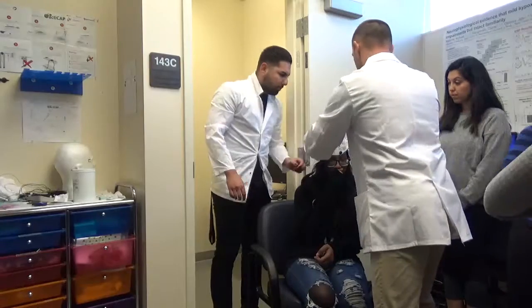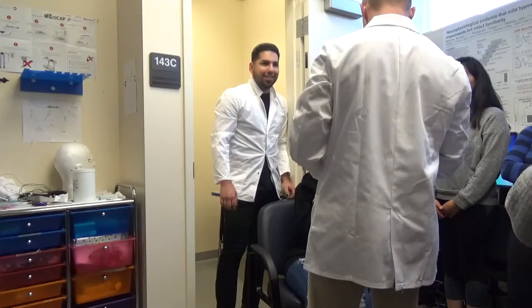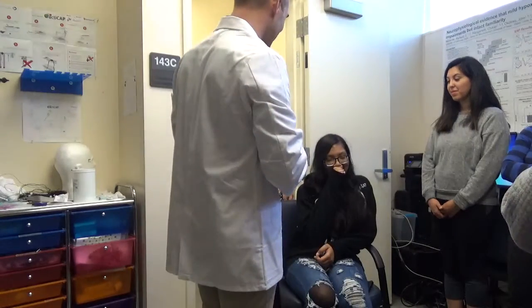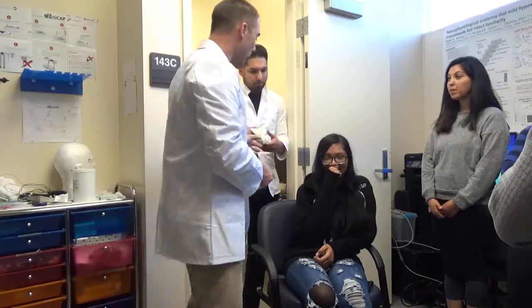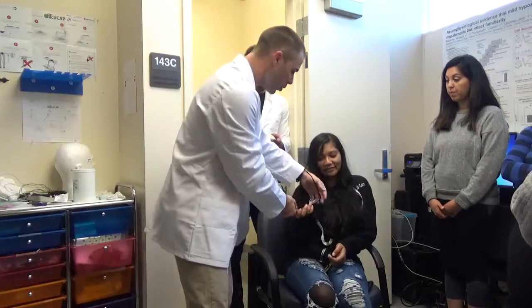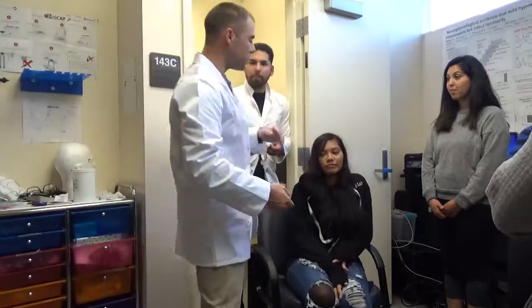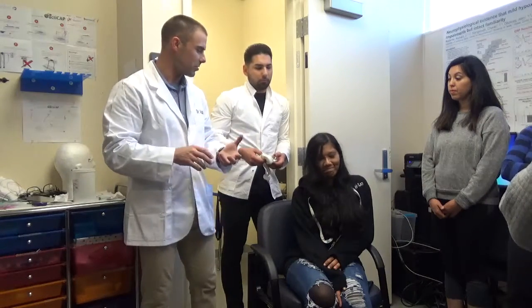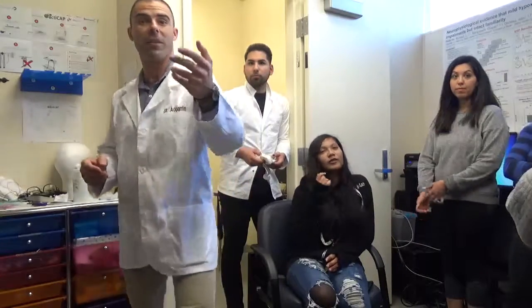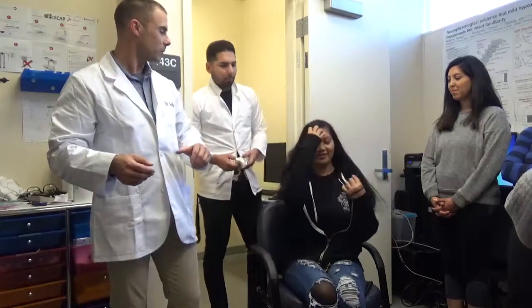So the first thing we're going to do, as we set this up for real, is, you okay? Yeah, I'm okay. It just feels weird. Yeah, it's going to feel a little weirder when we put the gel in. Okay? Hold that. As you put the cap on, you've got to take your glasses off for just a minute. Is that okay? Yeah, that's fine. We'll put them back on in just a second. Okay, so we put those there. And then what we tend to do, especially with ladies with long hair, is we ask them to put it in a low ponytail. Do you have a scrunchie? You got it? All right. Do you think you could indulge us with a low ponytail? Sure, I guess.